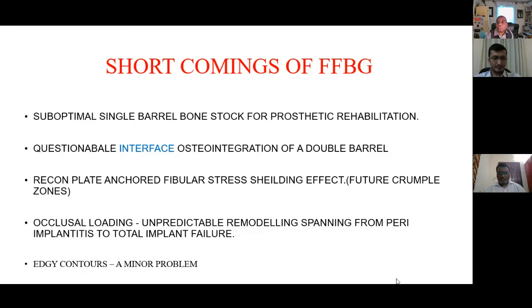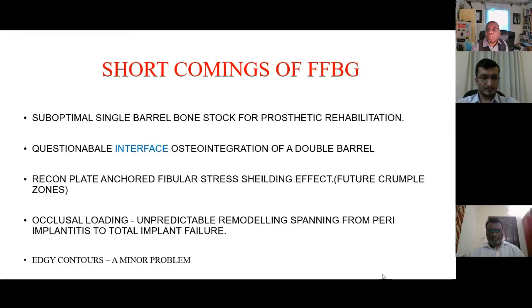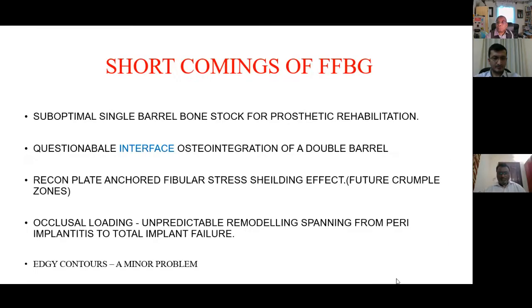When we position it horizontally and load it with perpendicular occlusal loading, there is always a possibility, ranging from peri-implantitis to total implant failure. That's what I have encountered in, say, 4 out of 10 cases in our institution, with a lot of help from plastic surgeons and prosthodontists. Still, maybe we're too naive and we need to evolve a lot.